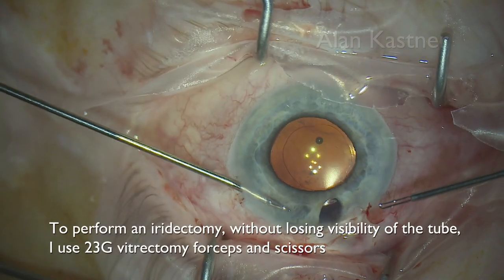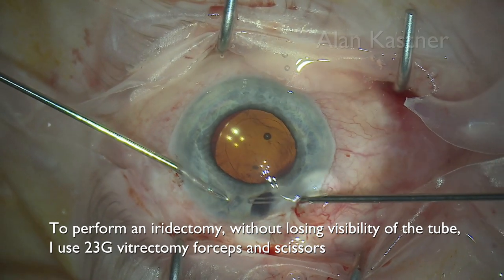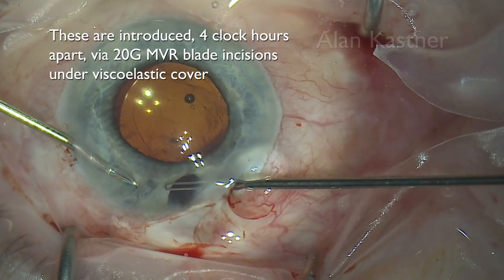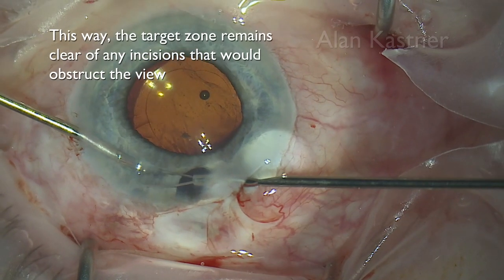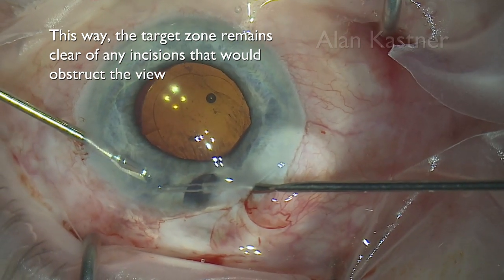To perform an iridectomy without losing visibility of the tube, I used 23-gauge vitrectomy forceps and scissors. These are introduced four clock hours apart via two 20-gauge MVR blade incisions under viscoelastic cover, so the target zone remains clear of any incisions that would otherwise obstruct the view.